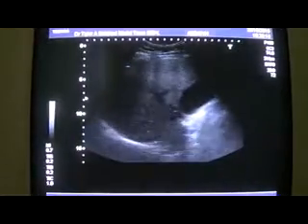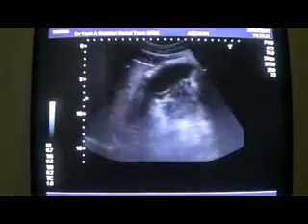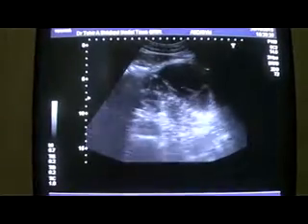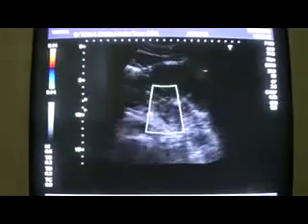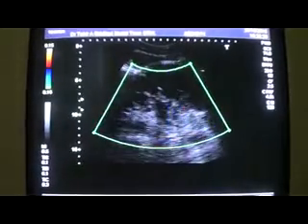There is a complex cystic mass seen in the region of the epigastrium. I place the probe in the region of the epigastrium transversely — this is a transverse section — and there is a multiloculated cystic mass.